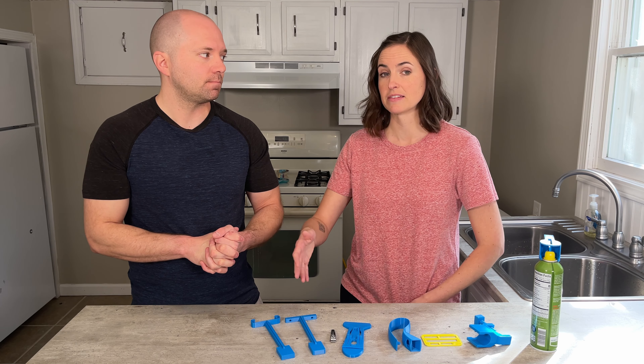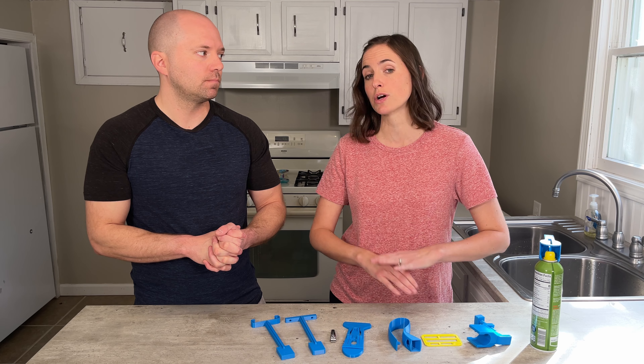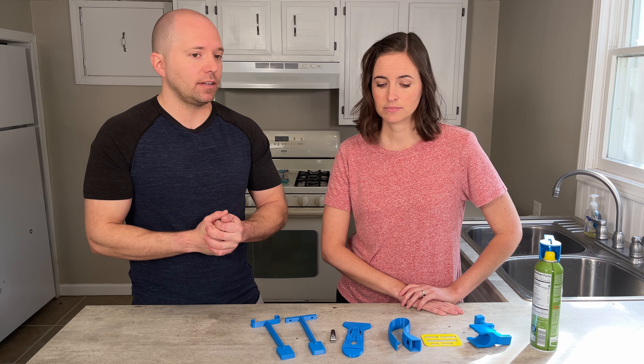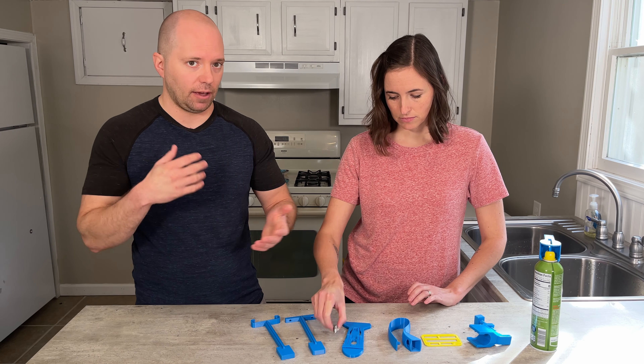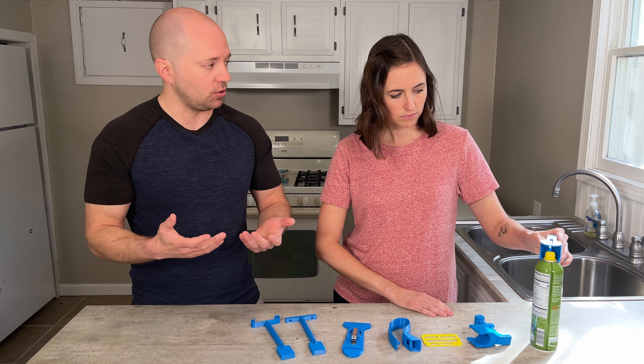And of course there's the do-it-yourself option — you can get a 3D printer and some filament and print out a model yourself. I'm shocked at how quickly it was to set up and start printing these kinds of things. It's kind of a game changer if you're somebody who's really interested in this type of work.